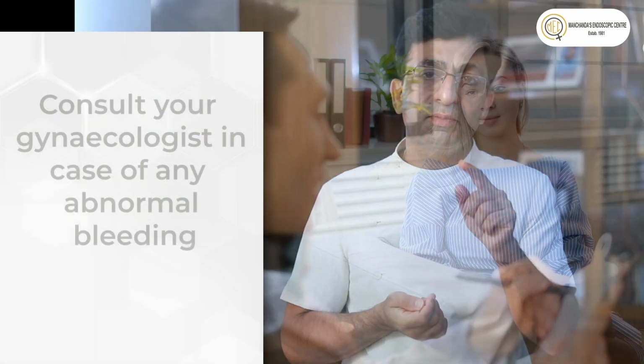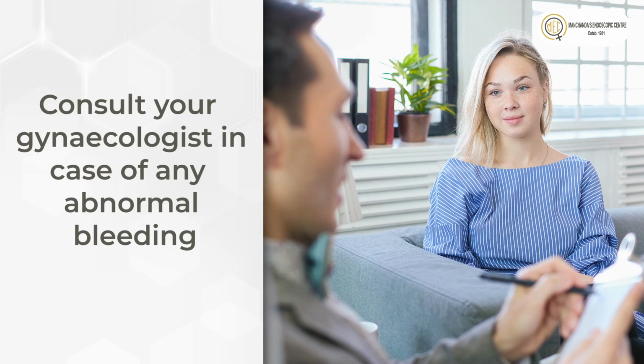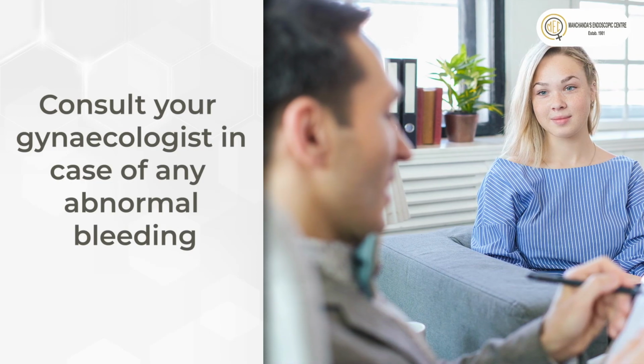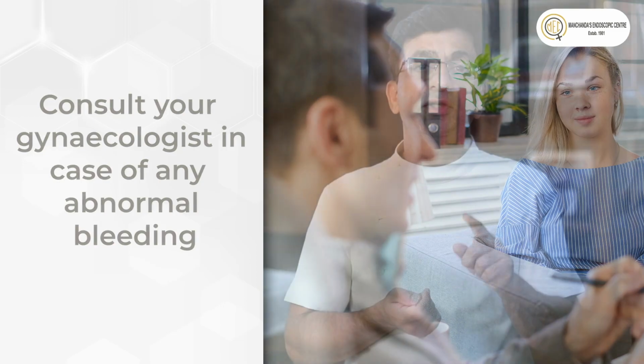So if you have any abnormal bleeding, please see your doctor, and if they advise you a DNC, tell them that you wish to have a hysteroscopy instead, which is now the standard and gold standard procedure to see and treat any bleeding problems.